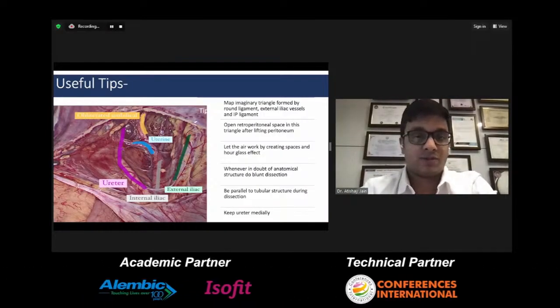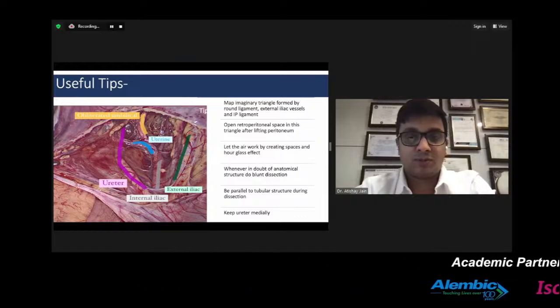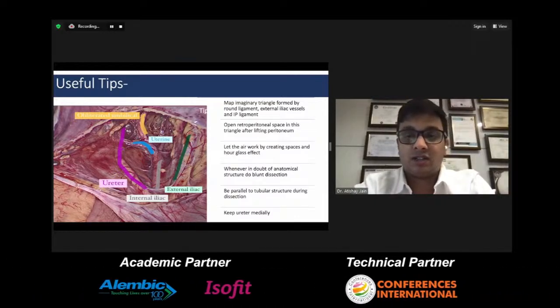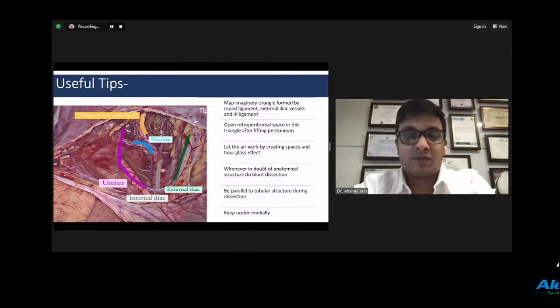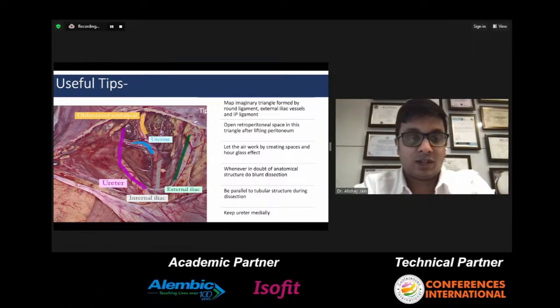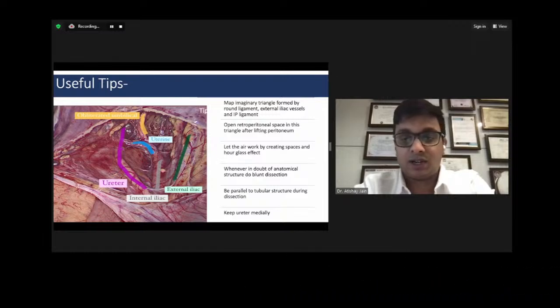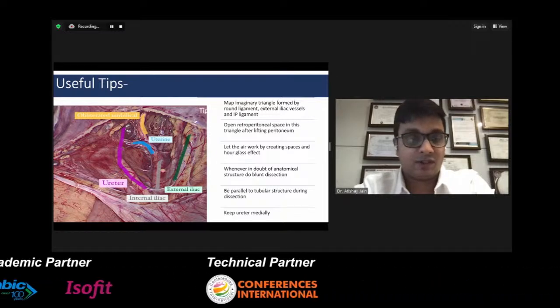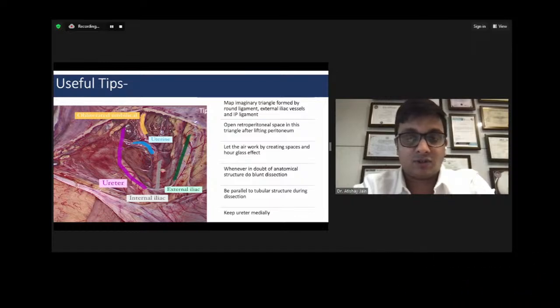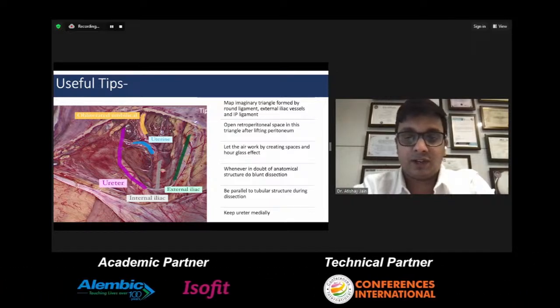So there are some useful tips to go into this space. Firstly is mapping the imaginary triangle and then opening the retroperitoneum. After lifting the peritoneum, you can do it with either one helper hand or just your left instrument. And the gas does a lot of work for you. So let the gas show its effect.